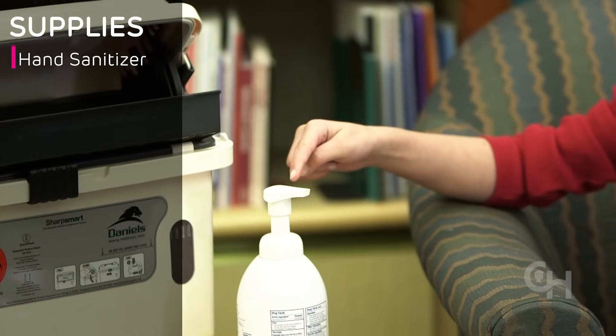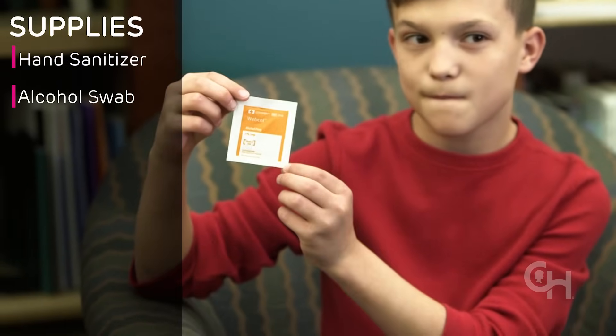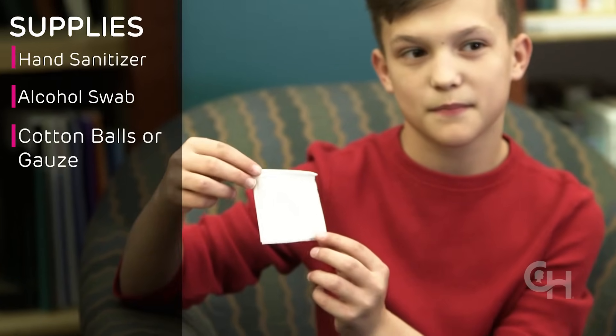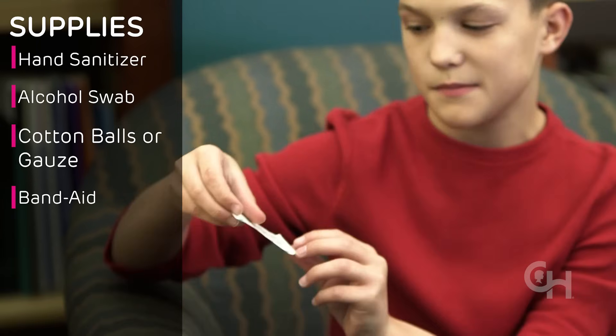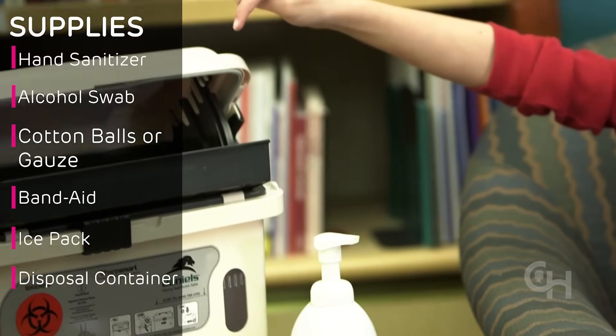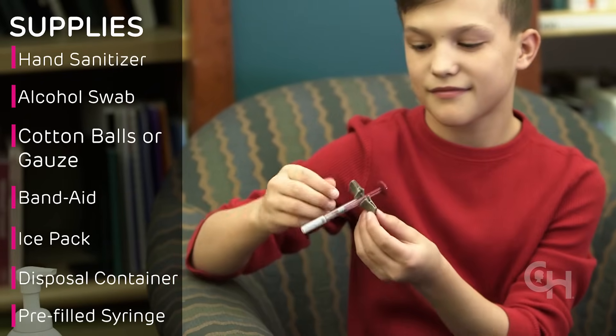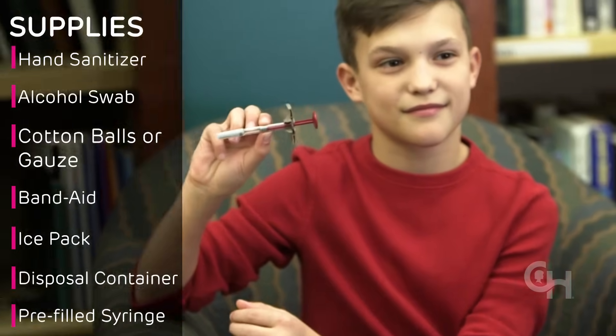The first step is to gather your supplies. You'll need a safe, clean area to get your medicine ready, and you'll need the following supplies: hand sanitizer, alcohol swabs, cotton balls or gauze, a band-aid, ice pack, a hard plastic container for throwing away the used syringes, and the medicine at room temperature with the syringe and needle.